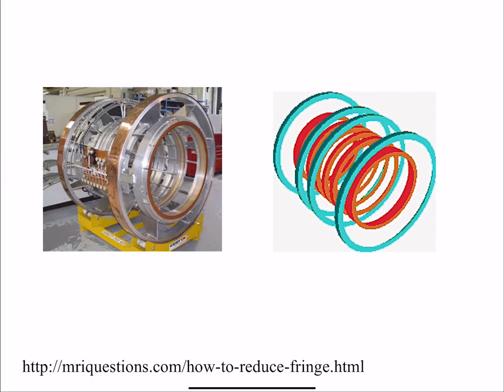One of the issues, and we'll talk a little about MR safety, is that in modern MRI systems we have the main coil here, and then we have the shielding, which uses counter currents. You have a very strong magnetic field, and it's a solenoid, so the magnetic field doesn't just stay in the magnet; the field lines go all around the magnet. So what would be the problem with having a room with a magnet and fields all around that room? Are there any safety issues with these fringe fields going all around? Anyone think of anything?